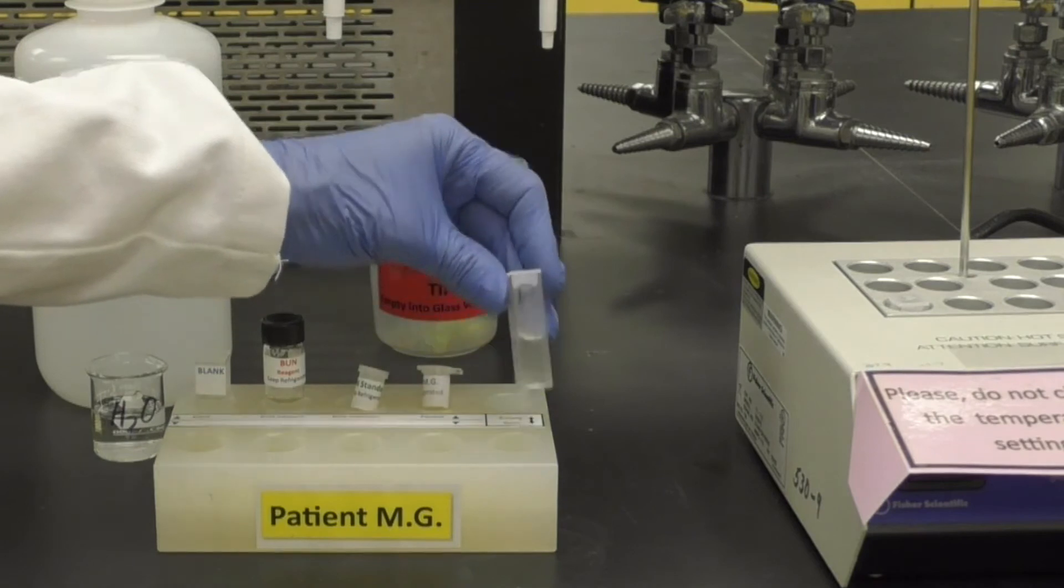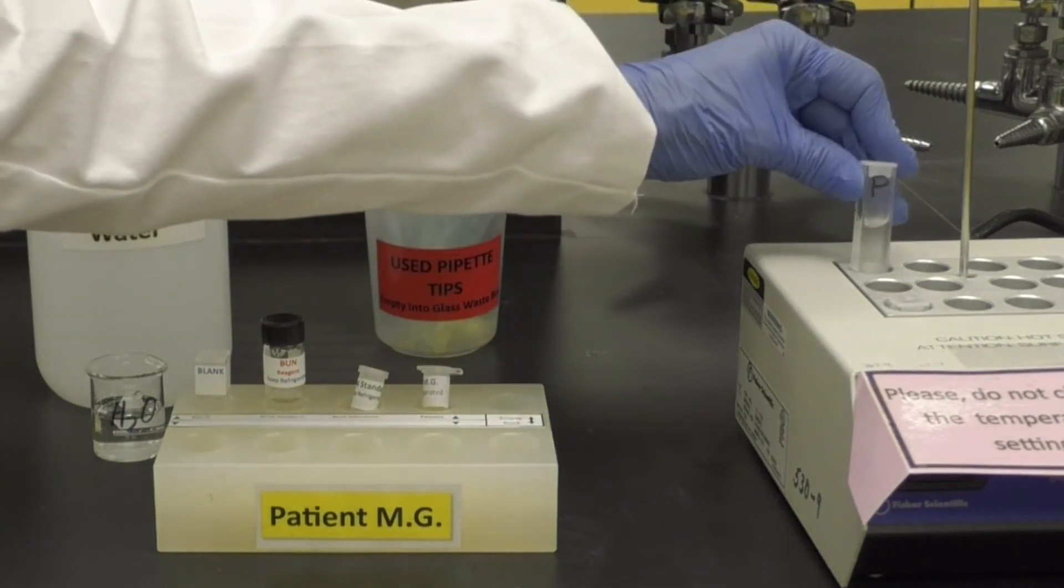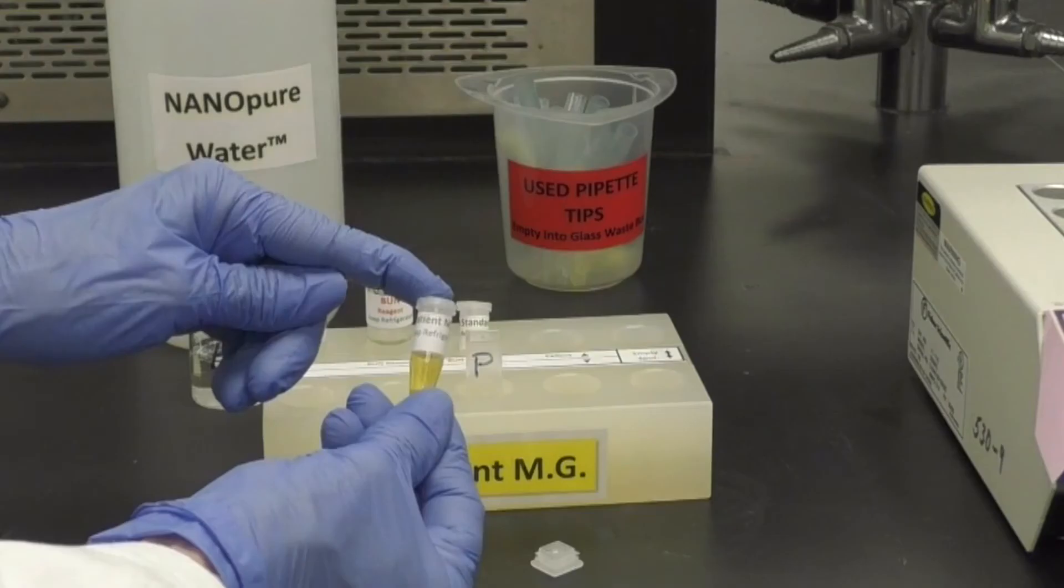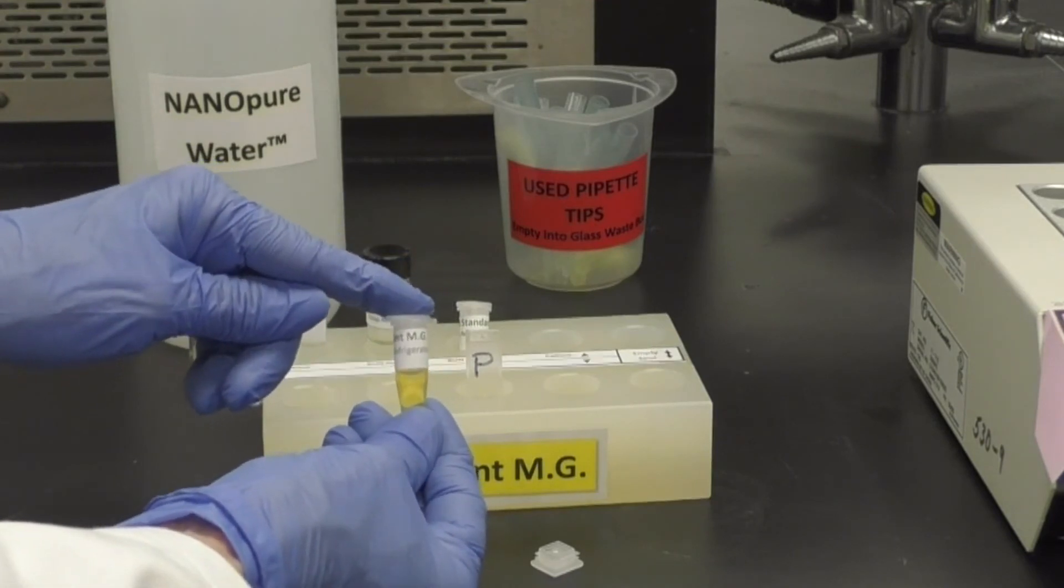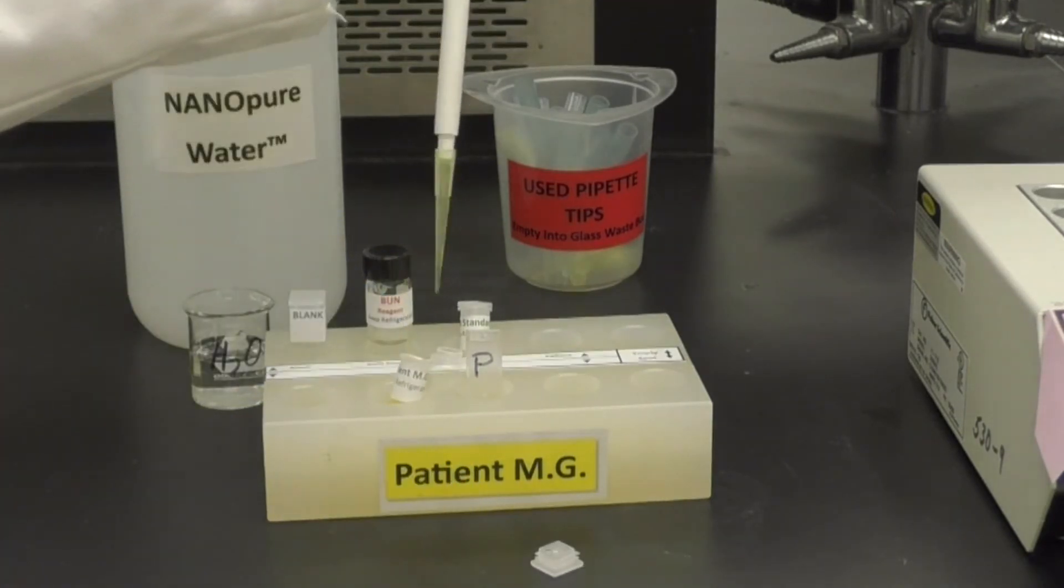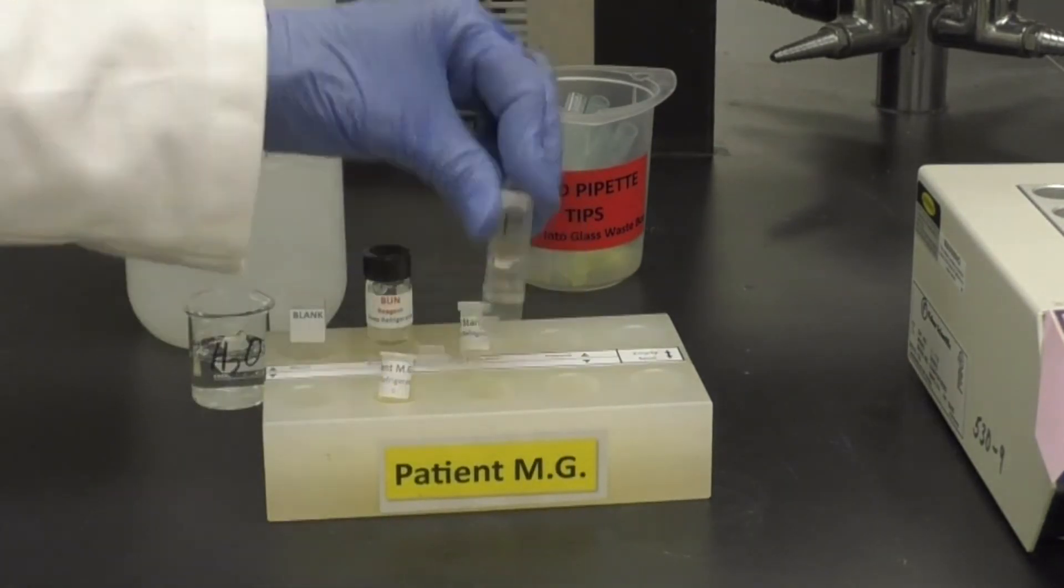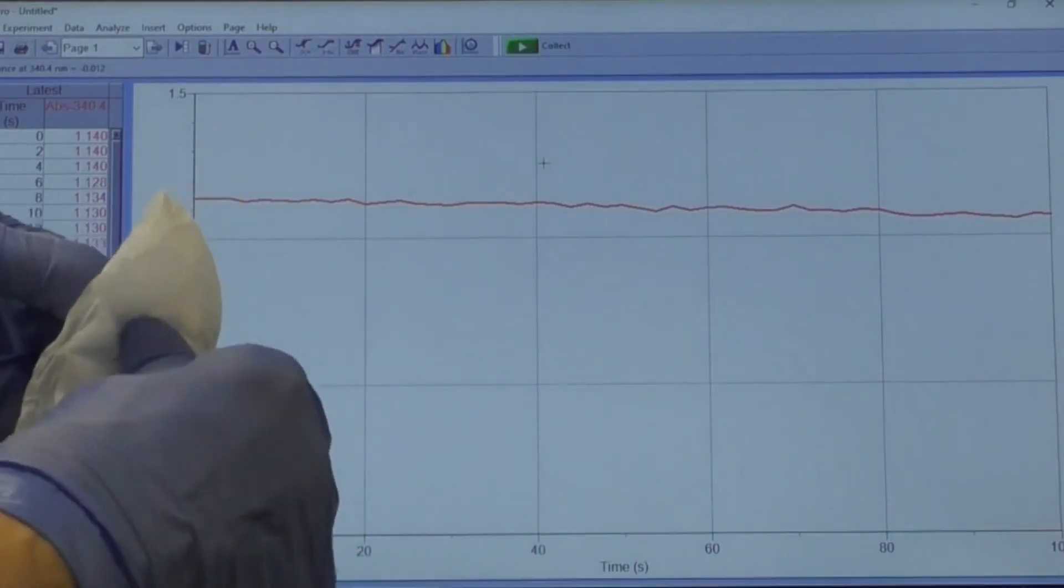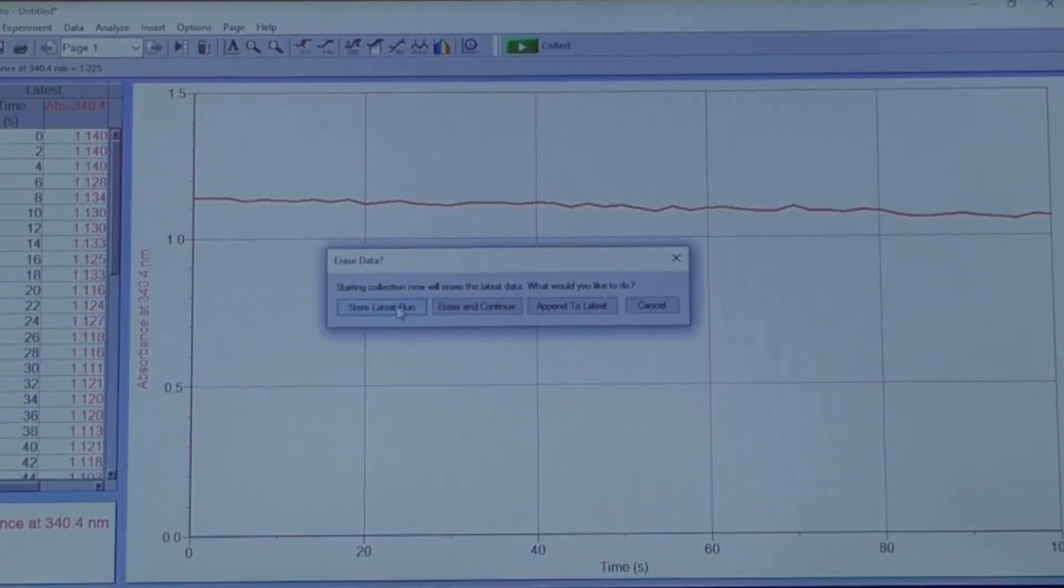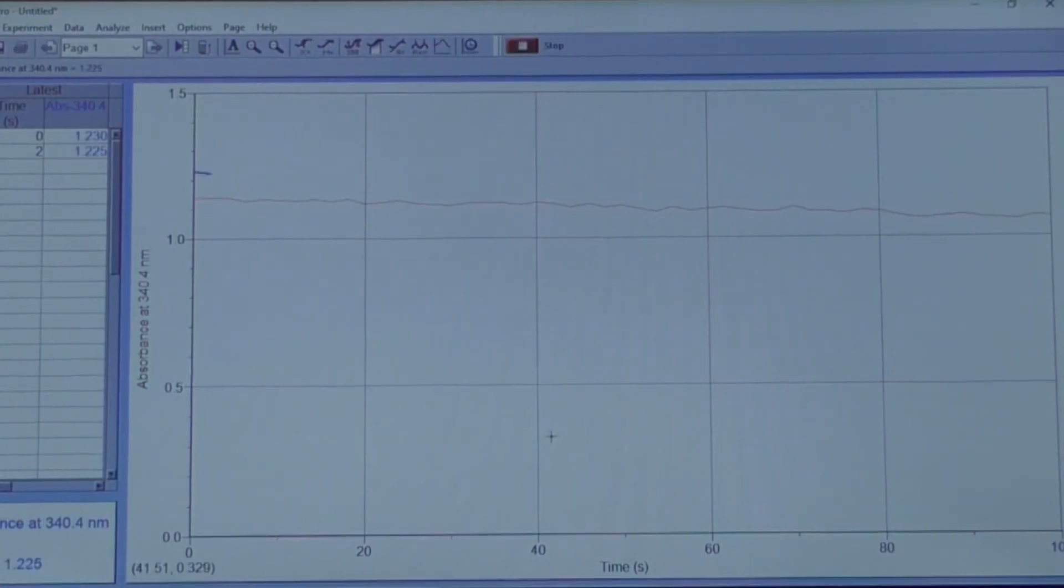While the standard is running, place the patient cuvette in the dry bath to warm for 5 minutes. When it is ready, add 20 microliters of the patient sample, rock to mix, wipe, place it in the spectrometer, and click Collect. Choose Store Latest Run. Again, do not click Stop.